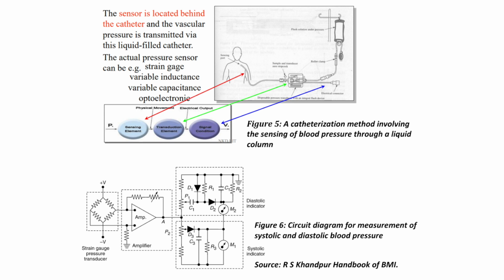The input stage is a differential circuit which amplifies pressure change sensed in the patient connected circuit. The gain of the amplifier can be adjusted depending upon the sensitivity of the transducer. After RF filtering, the signal is transformer coupled to a synchronized demodulator for removing the carrier frequency from the pressure signal. For the measurement of systolic pressure, a conventional peak reading type meter is used.